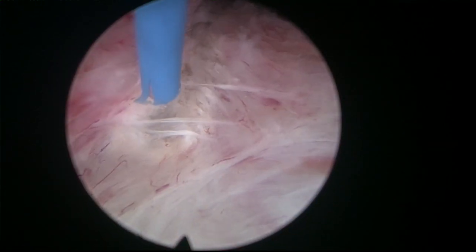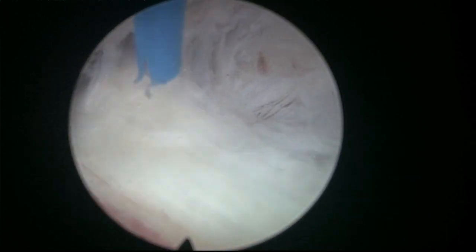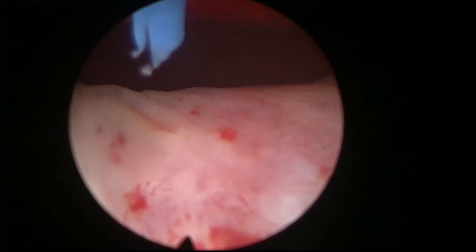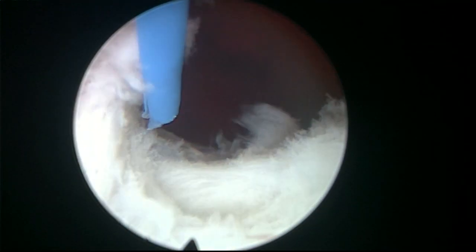That's the UO there. You see, it's very, very close. So I'm going to be very careful here, just as we did on the other side. Just try to release a little bit laterally here. Let's say from lateral to medial. Again, that's it. Now we can cut here. I think here it's safe. And again, we are making the hinge very thin in the midline.